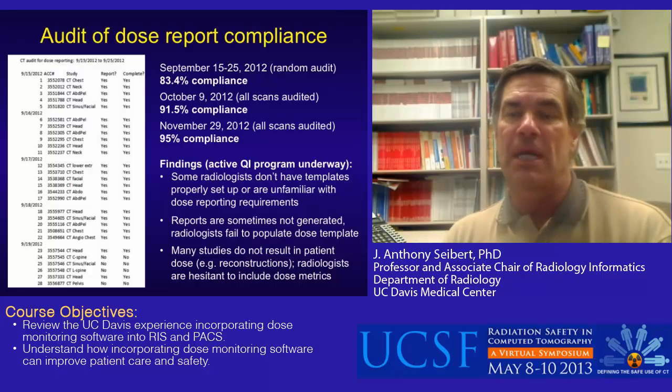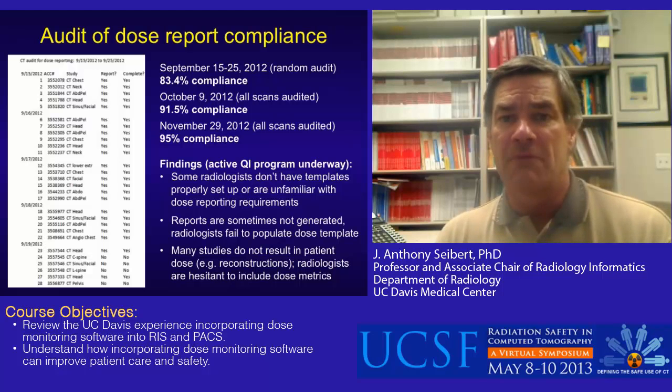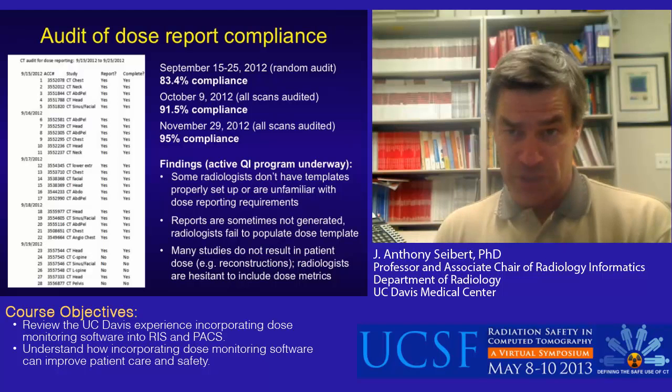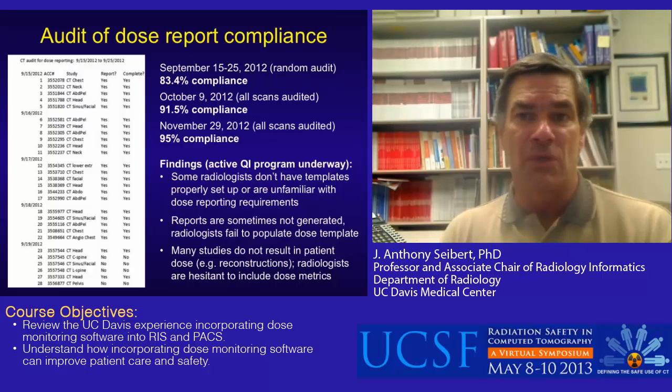on November 29, 2012. Findings of the investigation reveal that, in many cases, a lack of template setup is a major cause of not having reports. Reports are late or are missing, and the radiologist fails to populate the dose info. Many studies, such as reconstructions, do not result in patient dose. This can be confusing, and radiologists are rightly concerned about indicating dose when no dose was actually given.